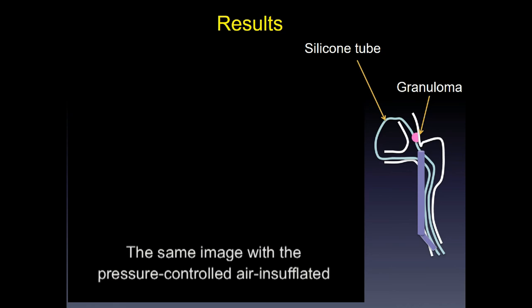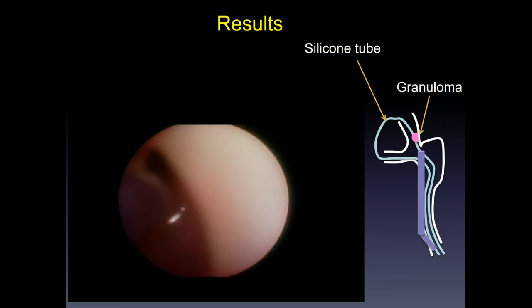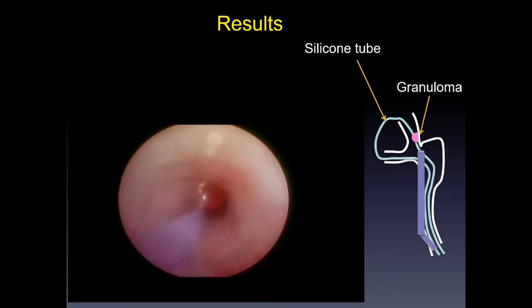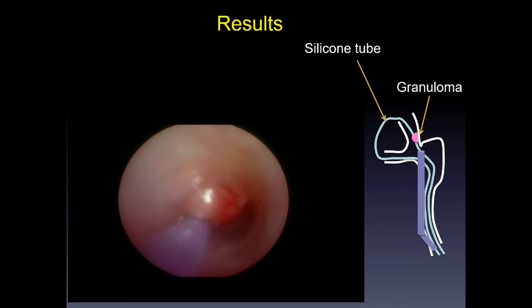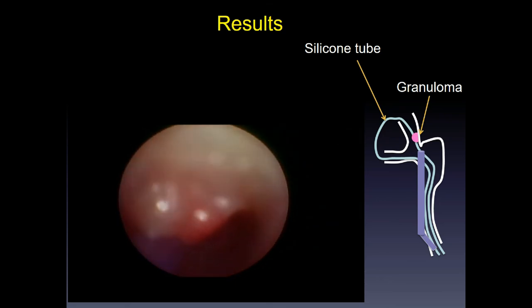The same area is now shown using pressure-controlled air-insufflated high-definition dacryoendoscopy. This is the canaliculus. This is the granuloma in the canaliculus, and here the scope passes under the granuloma.